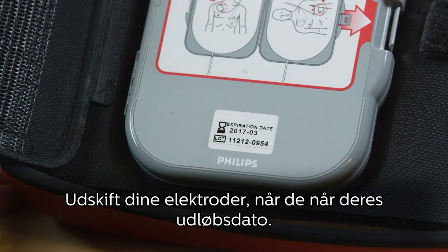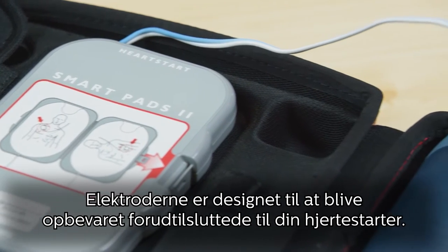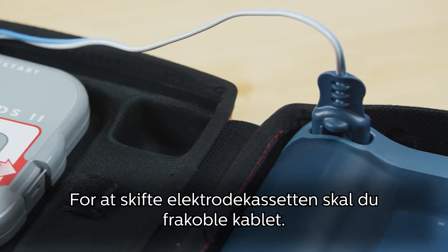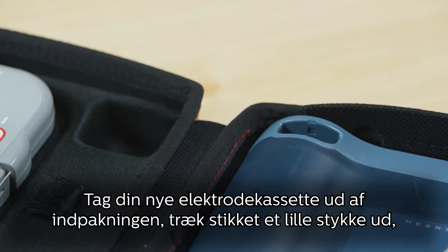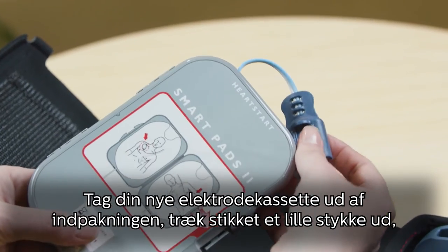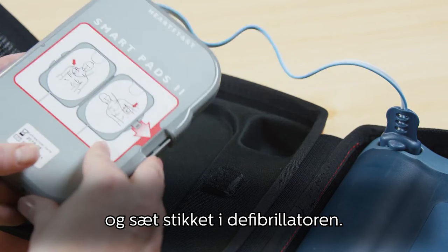Replace your pads when they reach their expiration date. The pads are designed to be stored pre-connected to your AED. To change the pads case, disconnect the cable. Take your new pads case out of its package, pull out the connector a short length, and insert the connector plug into the defibrillator.